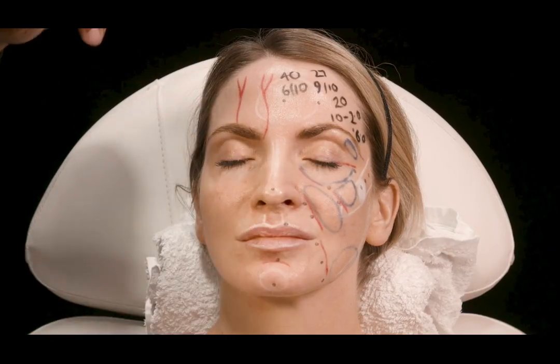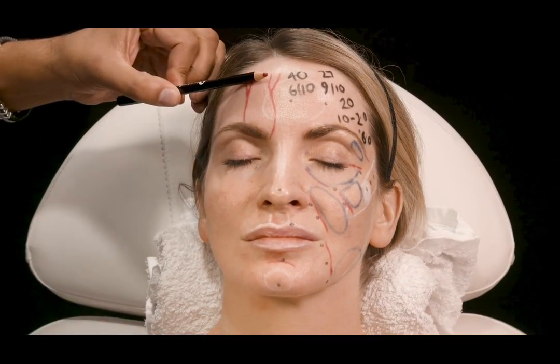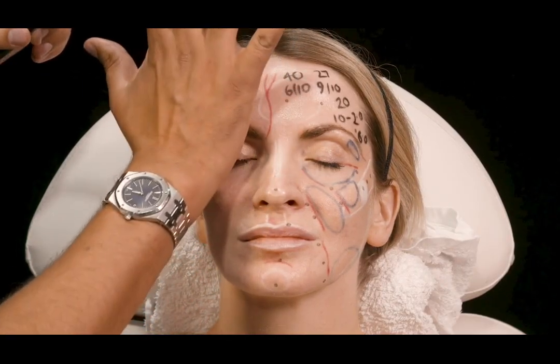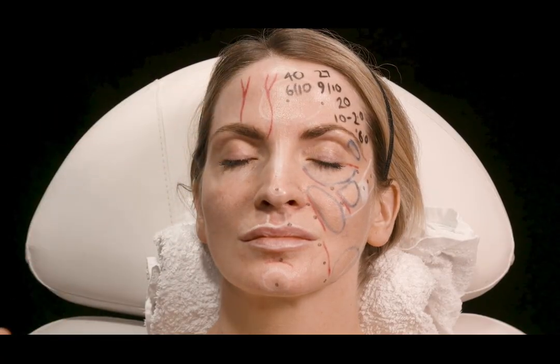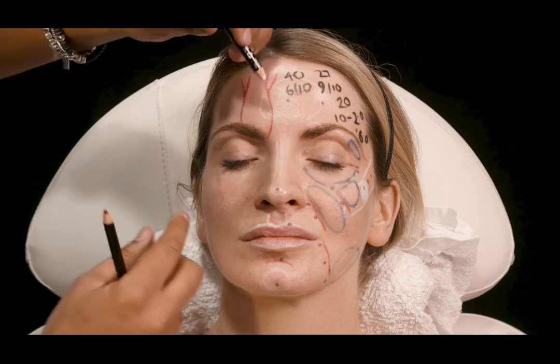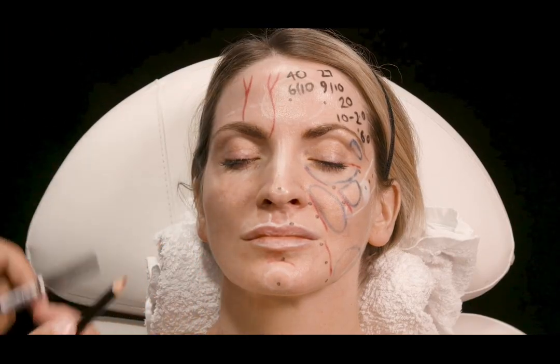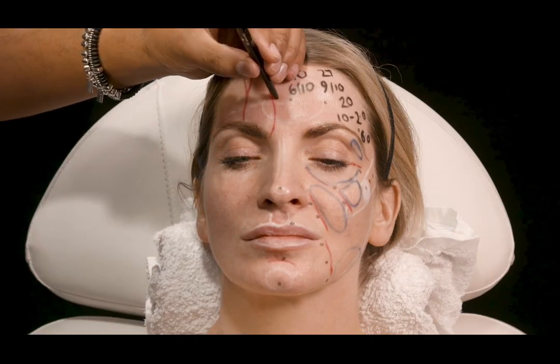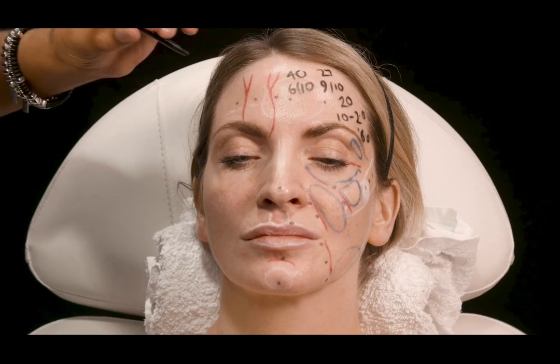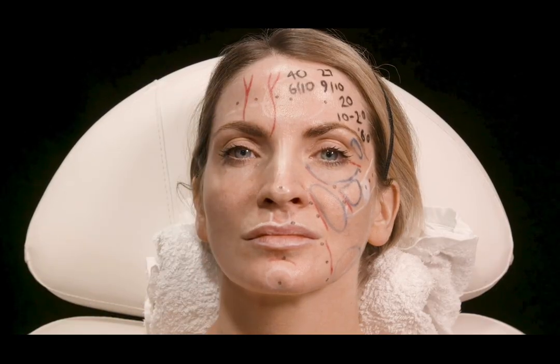Now, both of these vessels, when they enter the forehead, are on the bone. As they ascend up through the forehead, the vessels become more superficial, and at the 2 centimeter junction above the supraorbital rim, those vessels are subcutaneous. So this is the line typically where we see a depth change. So when we're injecting above that line, what depth do we need to be? Deep, right? On the bone, and you've got no risk. If you go superficial here, you're going to have a big vascular risk.